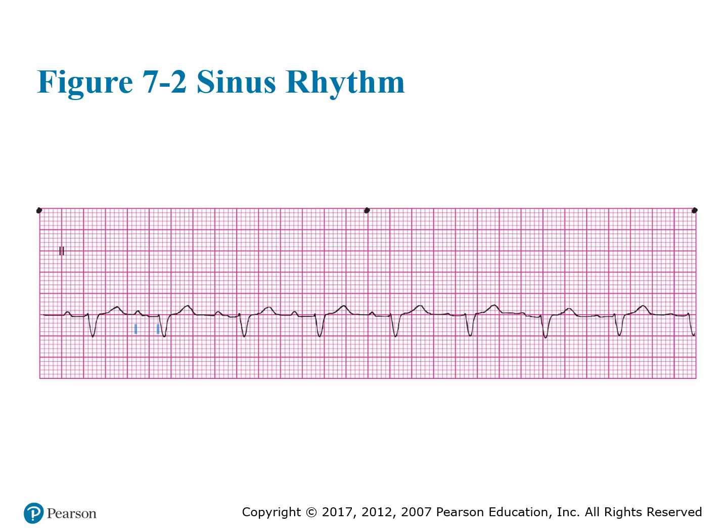Also measure the QRS. The QRS looks like it's going to be about 2 boxes, so that's probably going to be about 0.08 or so for the QRS. So the QRS is going to be within that 0.12 range. I would measure out your P to R interval here, though. If it's in range, it's right on the mark, right on the 0.2.